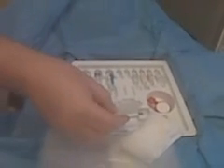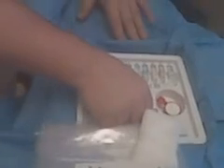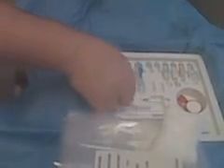Now at this point, I'm going to get the rest of my kit ready. So the first part that I've already used would have come set up on the top. But at this point, I'm opening up the rest. Fortunately, this time I do have a little bit of a work surface here. I'm not always guaranteed that, but at least I can set out the drugs that I need.